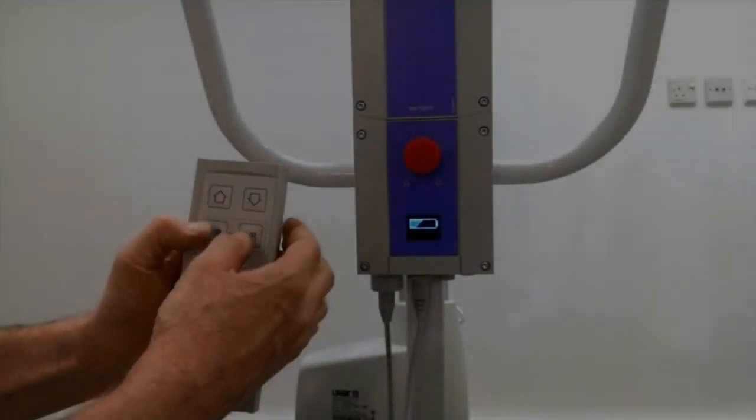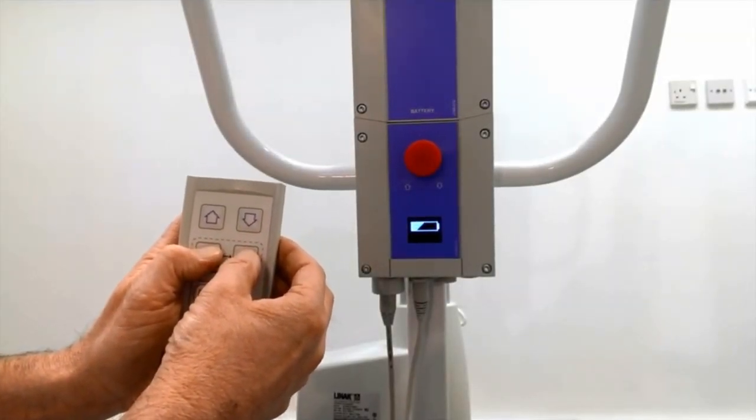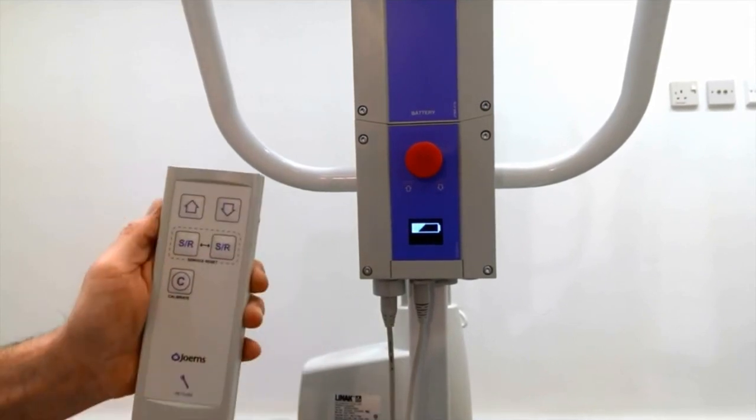To reset the service counter, press and hold the two service reset buttons simultaneously for approximately 5 seconds until an audible beep is emitted.